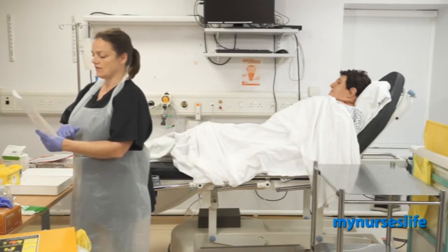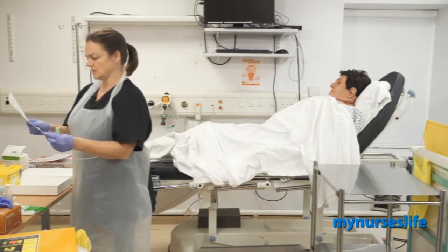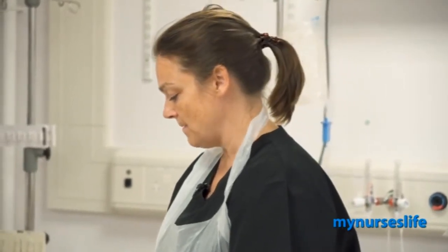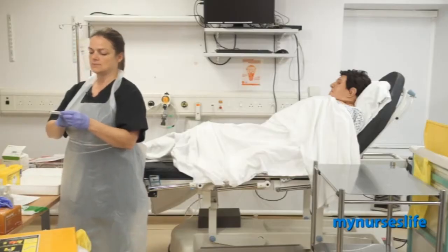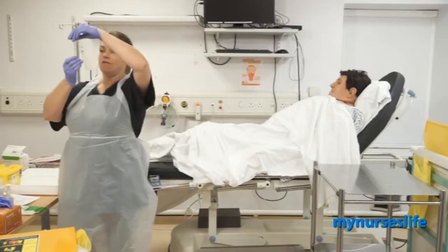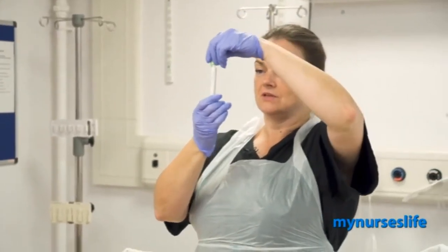The instructions are after breakfast, and she tells me she's had breakfast. It's signed by a doctor, and she tells me she doesn't have any allergies, and it's the correct time. So I'm happy to give it. This is the drug. It's Glargine. It says it's 100 units per mil, and it expires 10/20/20. The vial is clear and not cloudy, so I'm happy to use that.